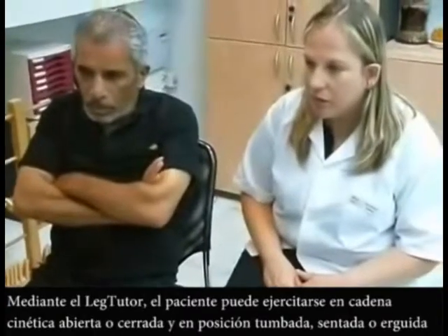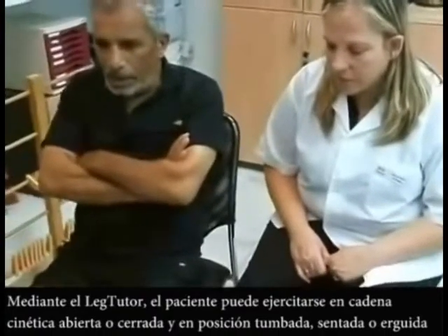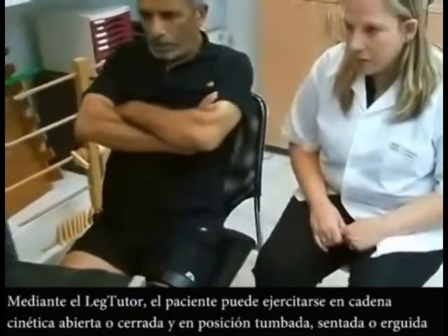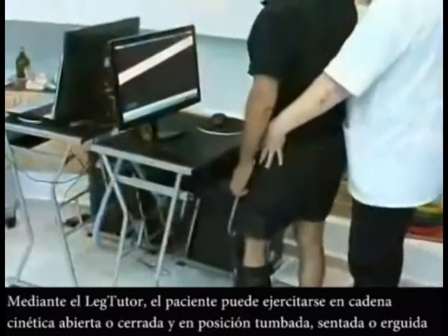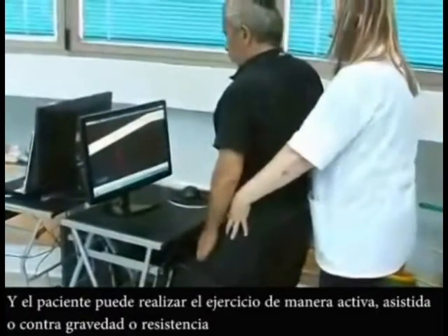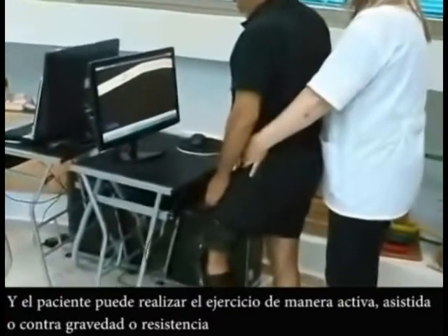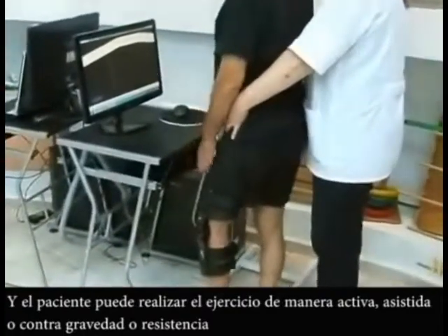Exercising with the Leg Tutor can be either open chain or closed chain, as the Leg Tutor can be used in the lying, sitting or standing position. The patient can also perform the exercises as assisted active, active, or against gravity and resistance exercise practice.